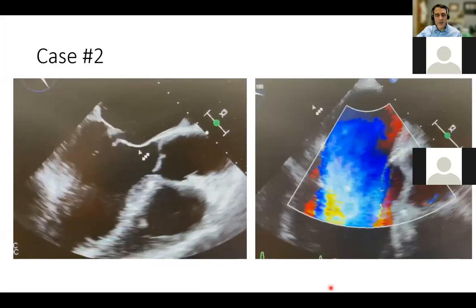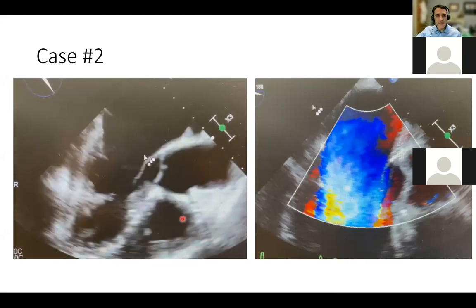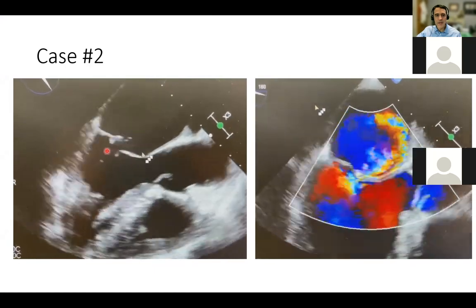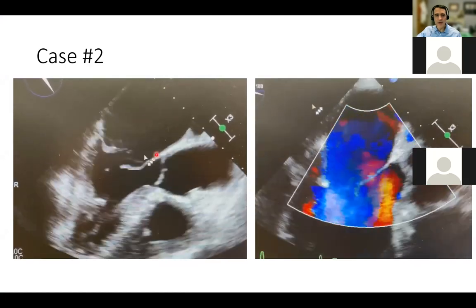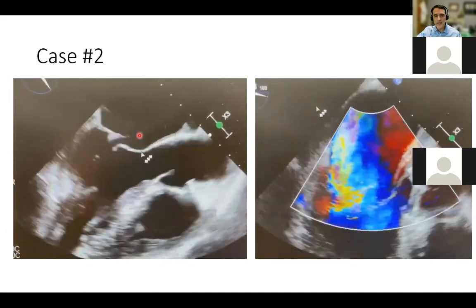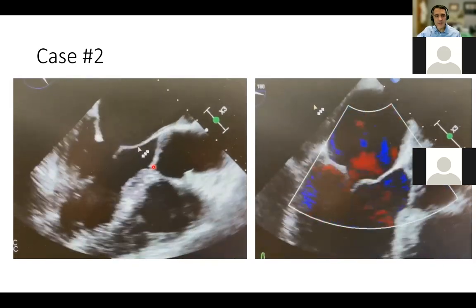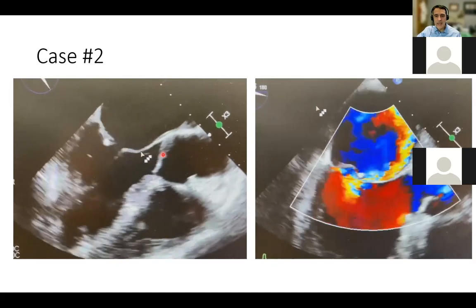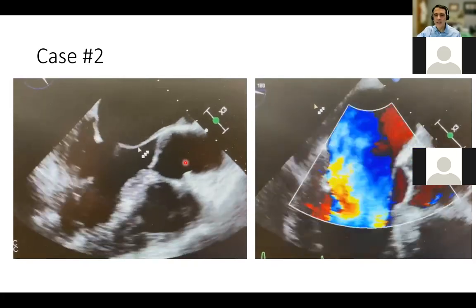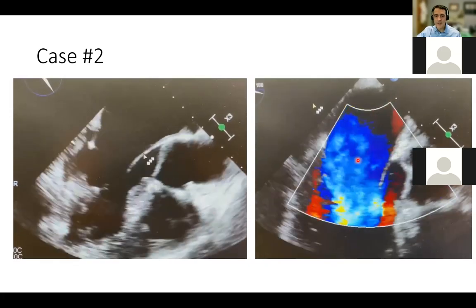The next case I want to show you is a little bit different. This is a completely different scenario where you have a structural valve problem. You can see here the leaflet is prolapsing above the other one. The leaflets are moving well, all the way to the annular plane, and there's clear rupture of the cord. This was a particular patient with previous heart surgery, some pulmonary hypertension, elderly, and quite deconditioned in many ways, that we assessed for MitraClip. And this is the jet of mitral insufficiency.